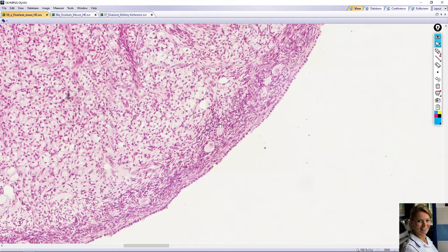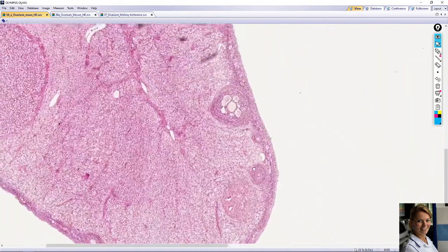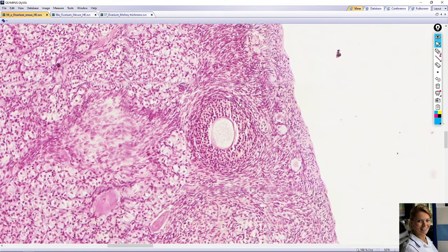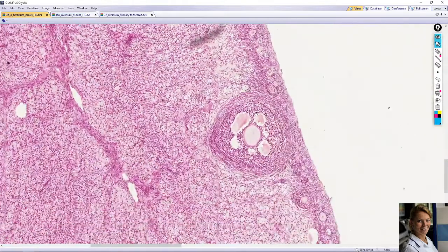Primary follicles contain one layer of cuboidal cells called follicular cells. Primary follicles also contain many layers of cuboidal cells. Secondary follicles contain small cavities filled by follicular liquid.